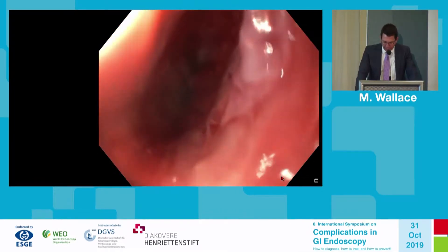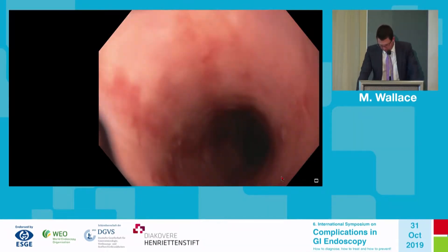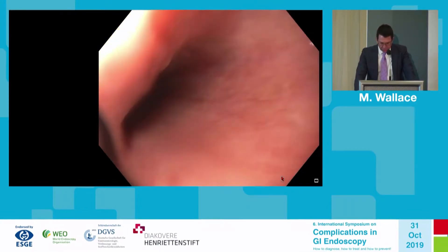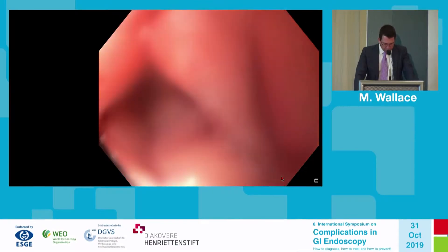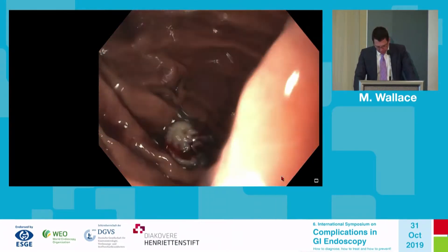There are some mucosal tears here, relatively superficial, but not completely inconsequential. There is also some blood in the esophagus. At the lower esophageal sphincter, there's a small hematoma that you can see.